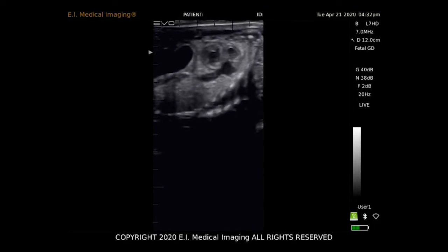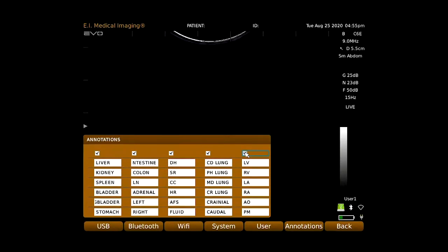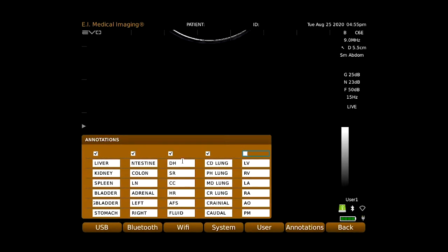Store still frames as well as video clips of any length. Lists of quick annotations come preloaded but can be edited to suit your needs at any time.